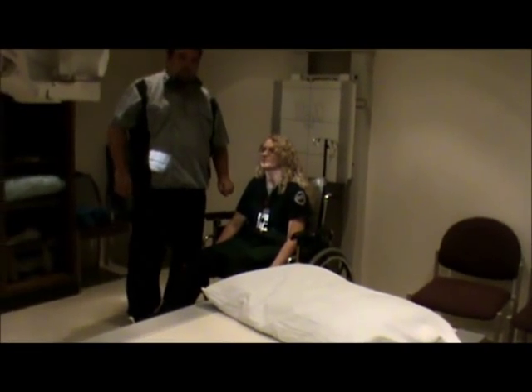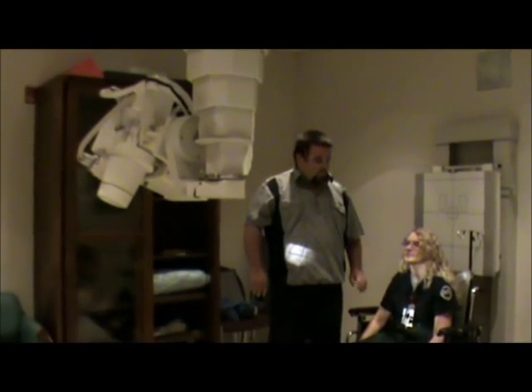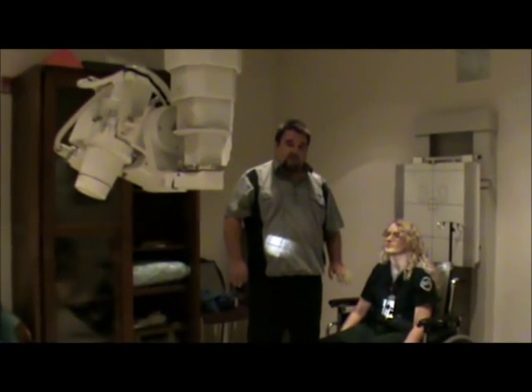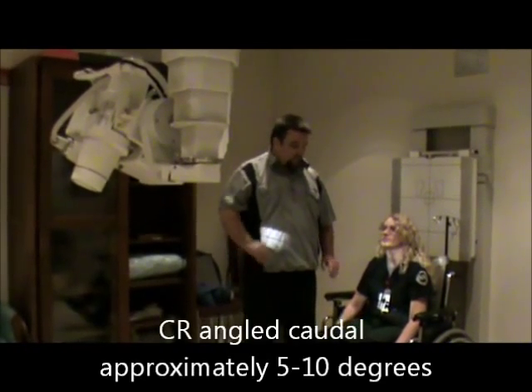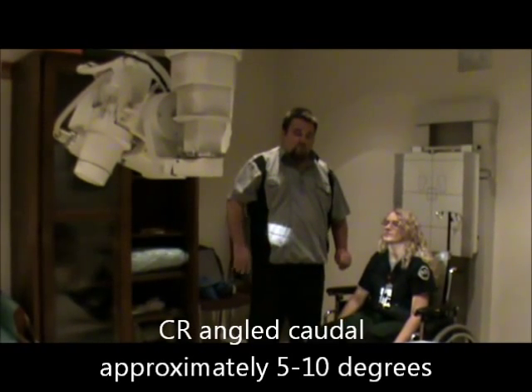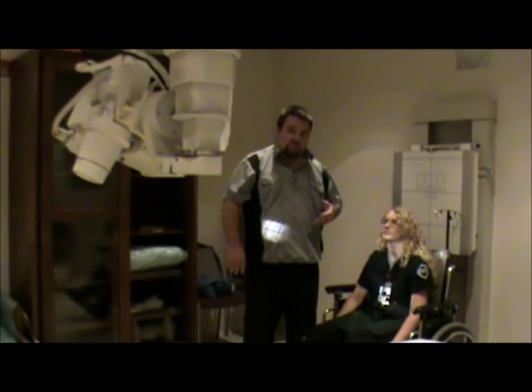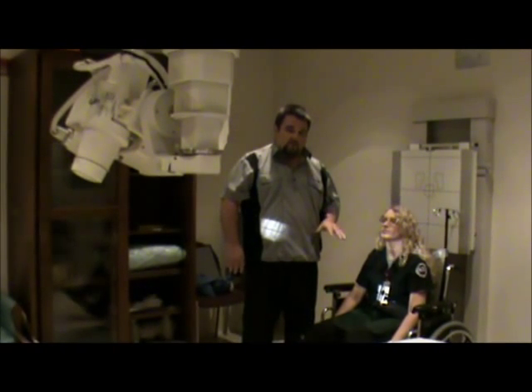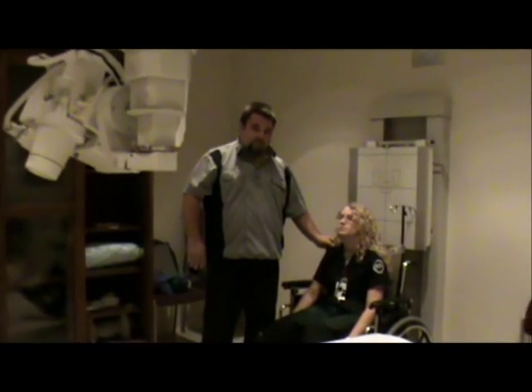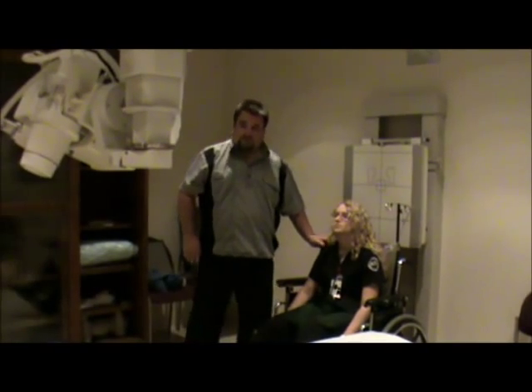We're going to angle the tube about five degrees caudal. We need to make it perpendicular to the sternum — the sternum is angled slightly. We want the clavicles to be below the apices of the lung, which tends to throw them down so that we don't have a lordotic-looking chest X-ray.